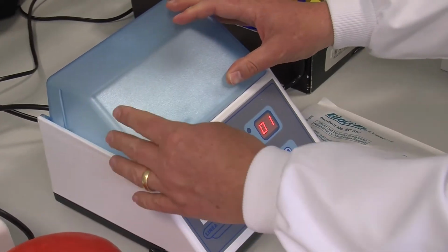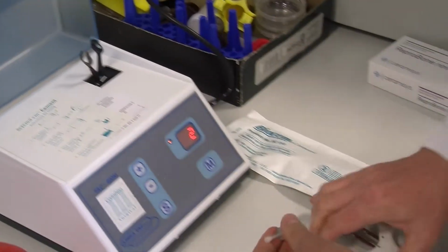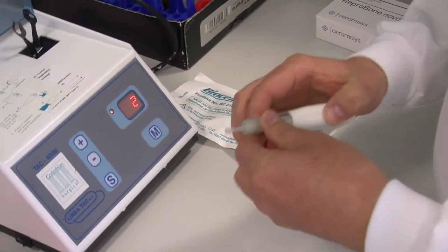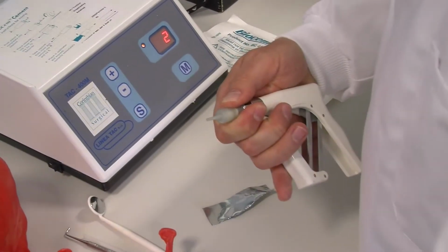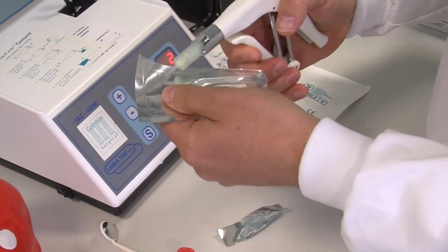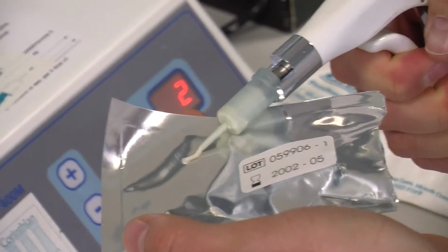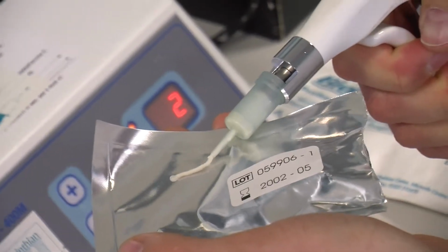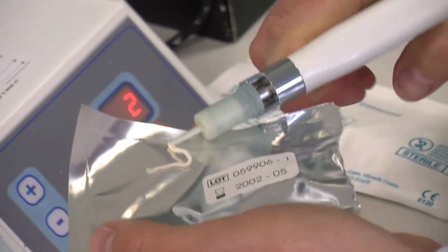3, 2, 1. Then you remove that, put it carefully into your injection device, remove the plunger from the end, and then here, again, this is what you're doing surgically to demonstrate. You squeeze here, and then the cement comes out thus. And the surgeon can place this directly in the middle ear, or they can manipulate it with their tools and instruments in theatre. So it's a very elegant system.